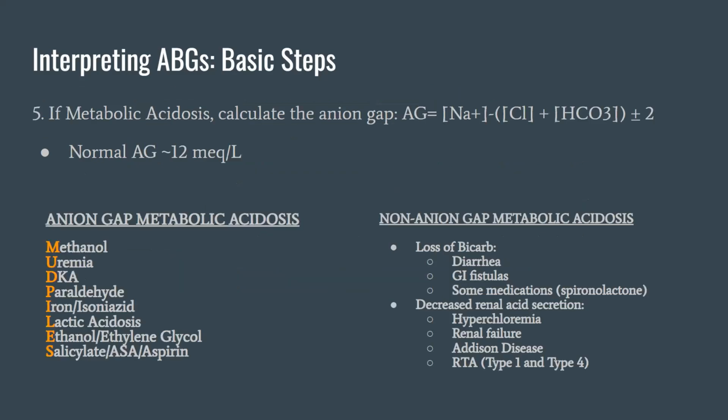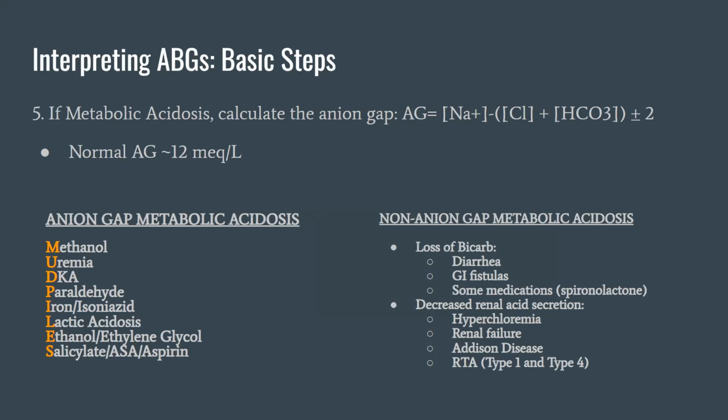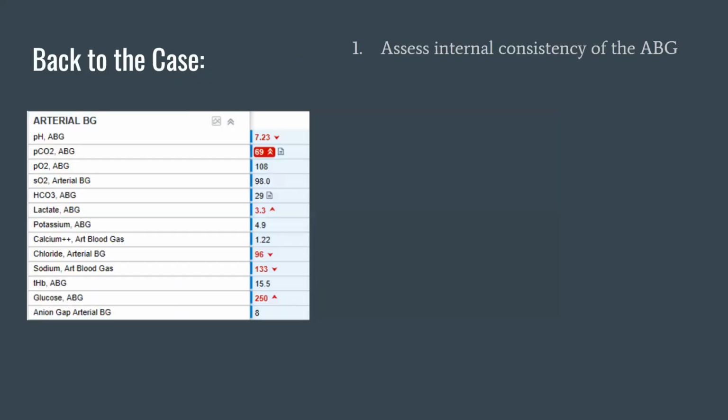And then whenever there's a metabolic acidosis, the medicine people will get really interested in the anion gap. And sometimes we might too here if it's relevant, but I feel like I can't do an ABG talk without talking about mud piles, because it's a thing that gets drilled into our brain in med school. But if you have a metabolic acidosis and the anion gap is high, the things here in PACU that are probably relevant, DKA and lactic acidosis, I think you guys probably see the most frequently here. The other stuff is more of an emergency medicine kind of deal. Again, this is more detail than is necessary, but you could see DKA, and certainly you guys see high lactates a lot here.